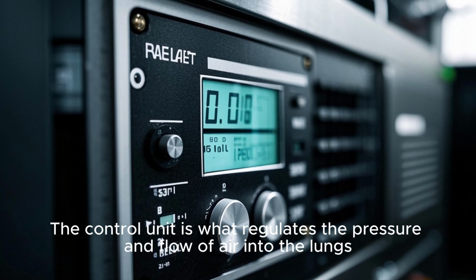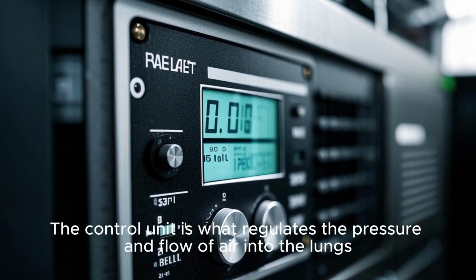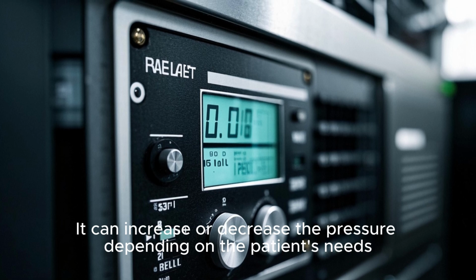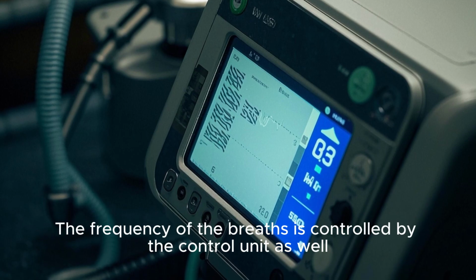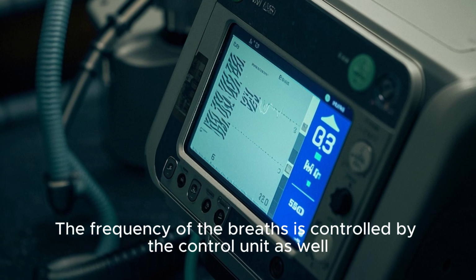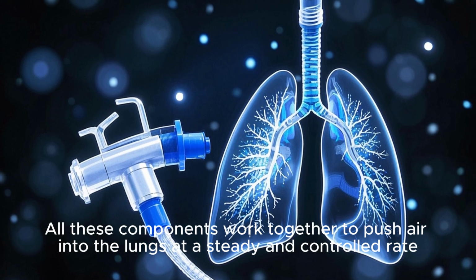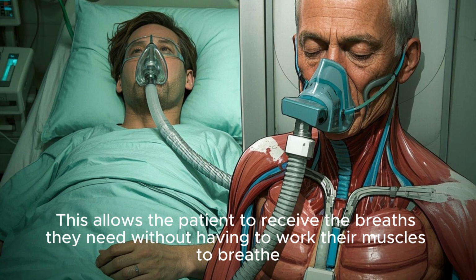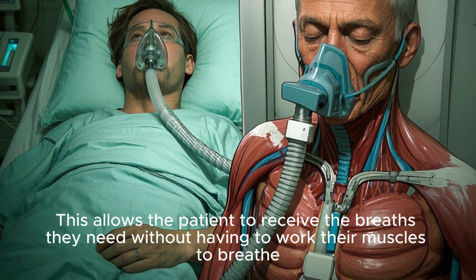The control unit is what regulates the pressure and flow of air into the lungs. It can increase or decrease the pressure depending on the patient's needs. The frequency of the breaths is controlled by the control unit as well. All these components work together to push air into the lungs at a steady and controlled rate. This allows the patient to receive the breaths they need without having to work their muscles to breathe.